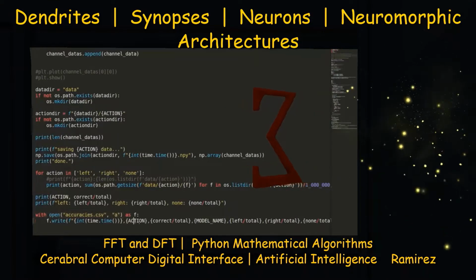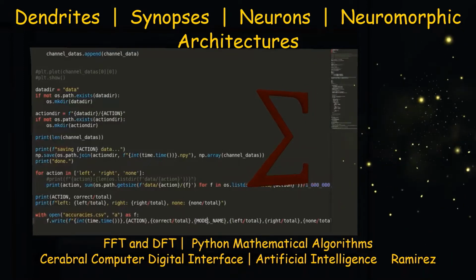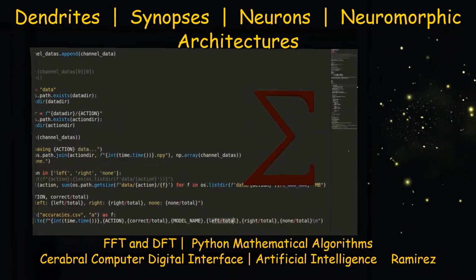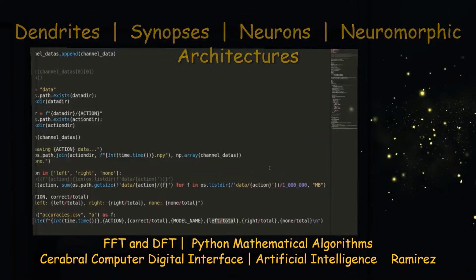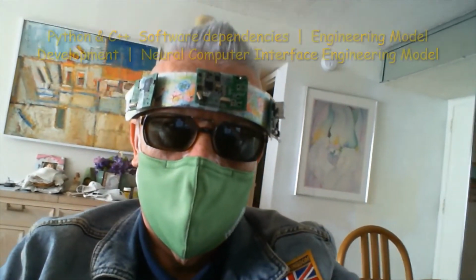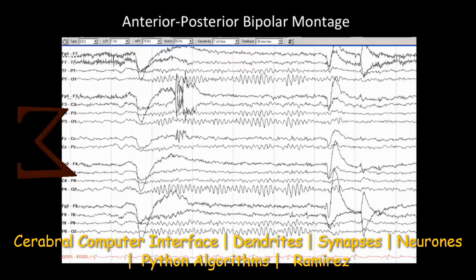So the classification segment in a BCI aims at translating the features into commands. In order to accomplish this task, I used regression algorithms, McFarland algorithms, and classification algorithms.